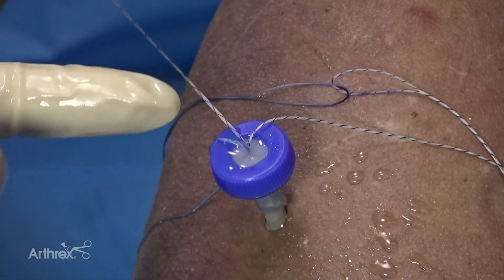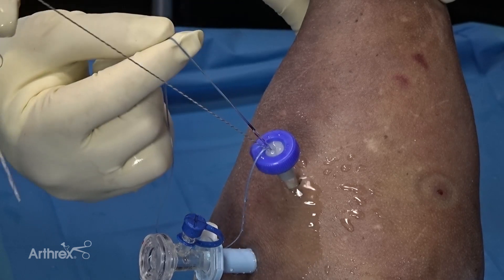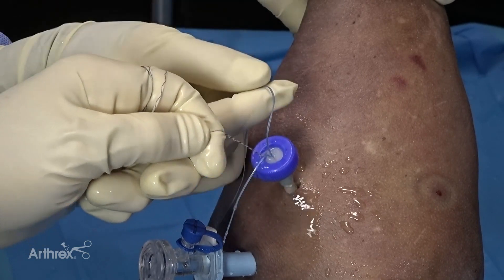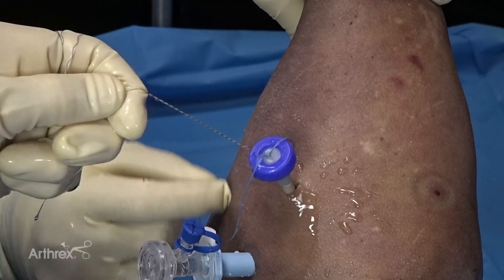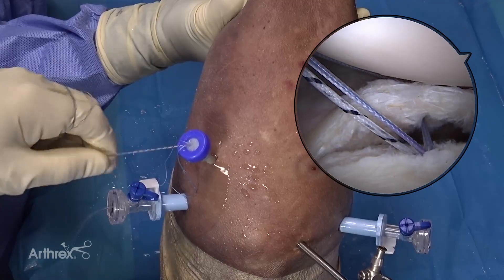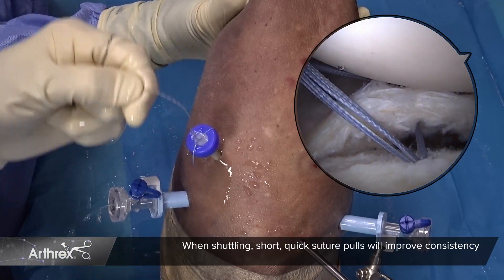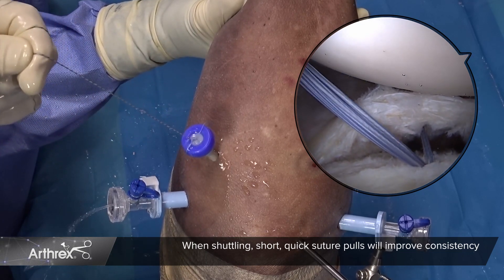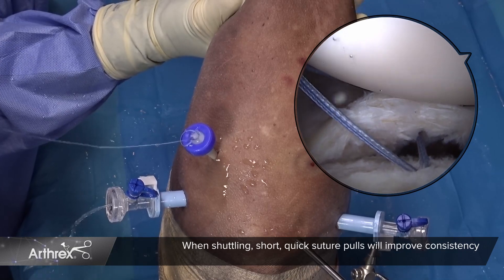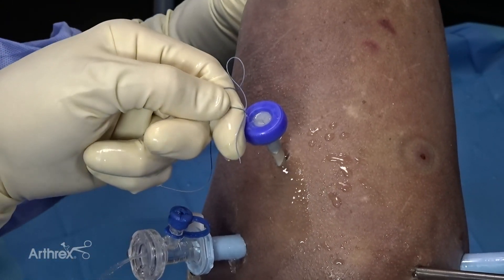Once the repair stitch is placed through the loop, have an assistant hold gentle tension on the repair stitch to allow easy sliding of the shuttle link until you can visualize the purple mark ready to enter the anchor. At this point, short, quick suture pulls will improve consistency. You can appreciate the end of the repair stitch as it's shuttled through the anchor. Now that our repair stitch has passed, I prefer to take some of the slack out of the repair stitch, but not to fully tension it.